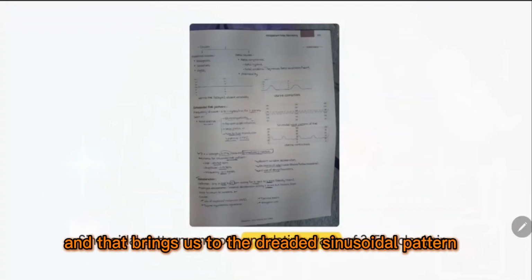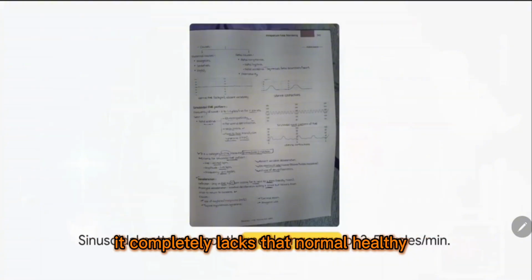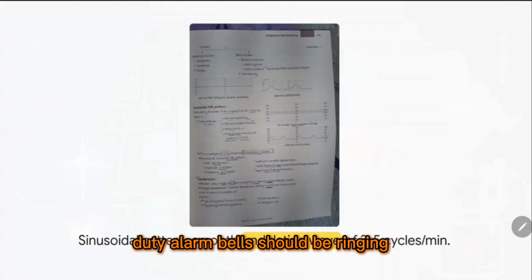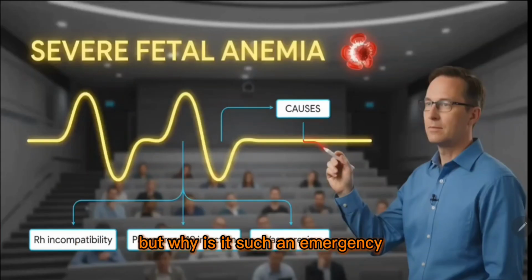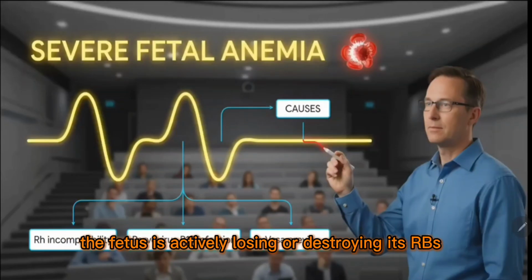And that brings us to the dreaded sinusoidal pattern. Notice this really smooth, undulating wave of 2 to 5 cycles per minute. It completely lacks that normal, healthy, jagged variability. Listen, if you see this on your ward duty, alarm bells should be ringing. It's a strict Category 3 CTG and requires an immediate emergency C-section. But why is it such an emergency? Basically, that smooth sine wave equals severe fetal anemia. The fetus is actively losing or destroying its RBCs.